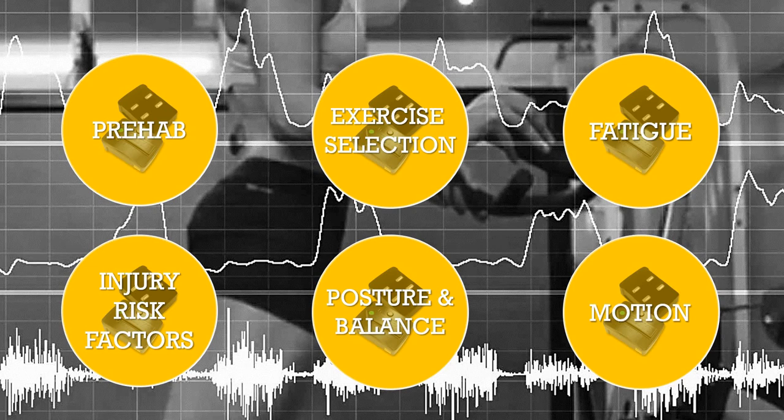It can be used in more clinical settings to assess things like posture, balance, fall prevention. We can also look to try and understand fatigue. Fatigue is a concept you may have covered in physiology, I'm not too sure off the top of my head, but it's a very hard term to define, because at what point are you truly fatigued?